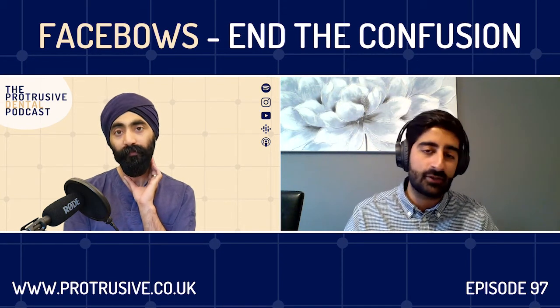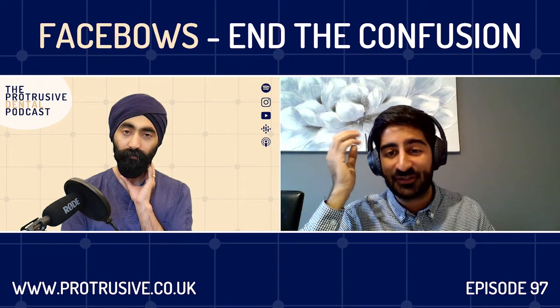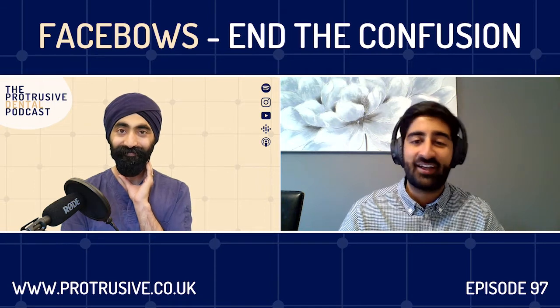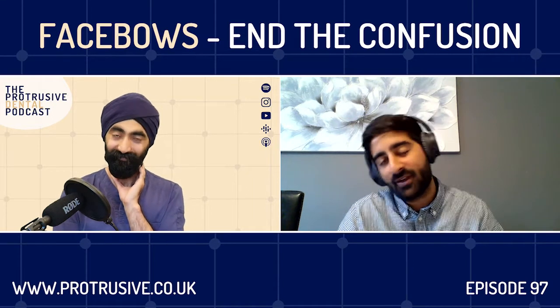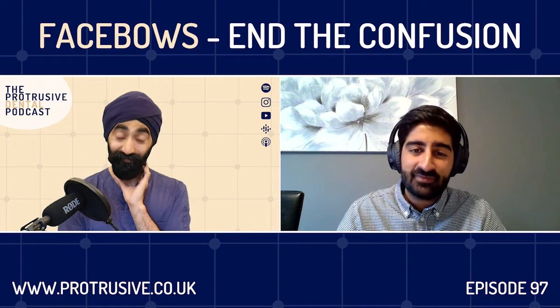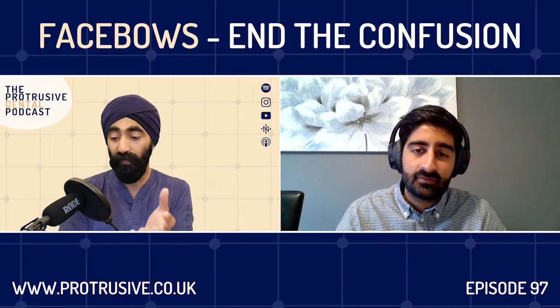So there's so many ways of doing this, but the main thing is you've got to think about the challenges that we give our technicians, because I never appreciated it. And now I do the lab work for my own patients. It's blind. If you think about it, they're sitting there with two casts and they haven't got the patient's face in front of them. And then suddenly when the work comes back and you complain, realize it's our fault in the first place. Absolutely. I mean, you're so right. All these challenges we face all the time. And so the more we give our technicians, the better.